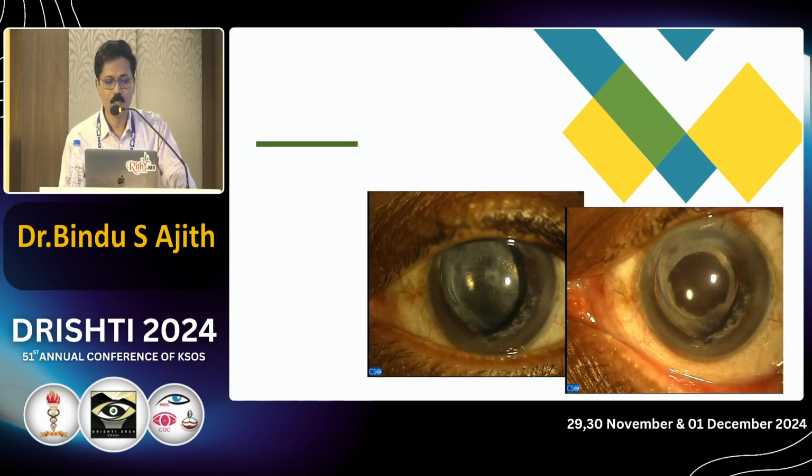So this is one of the cases which I had operated. In a similar case, I had put in a CTR also. The rhexis was slightly small, around 4 millimeters, and this is how the eye came after a couple of months. Total capsular phimosis, and it was not cutting with YAG also. So I had to go in again and cut it with a Vannas.